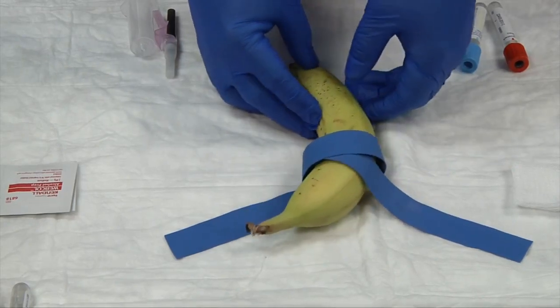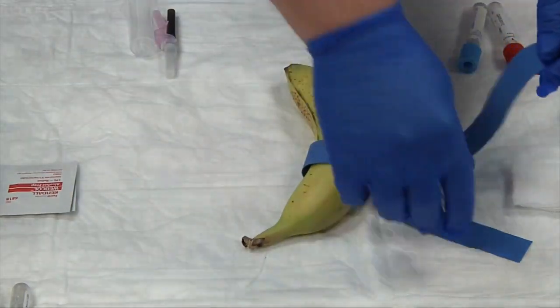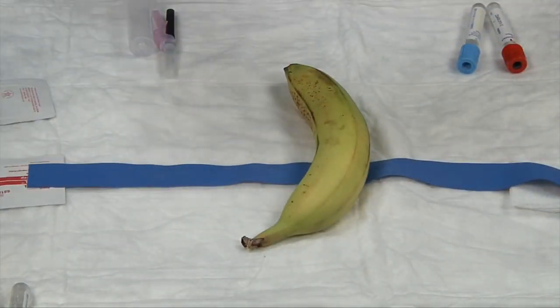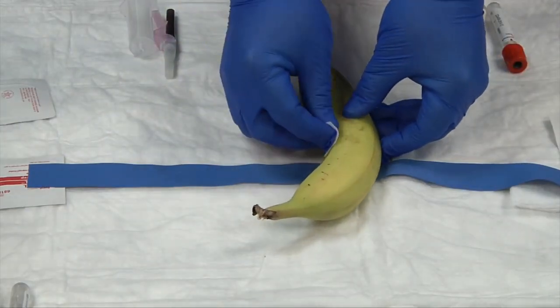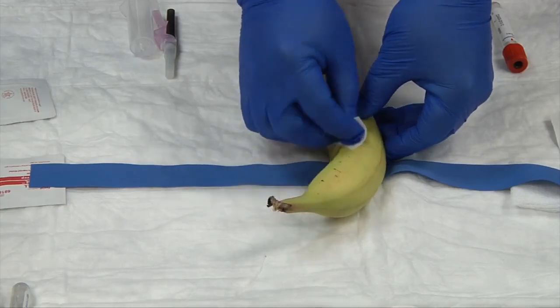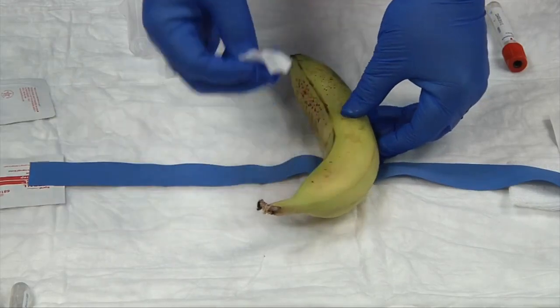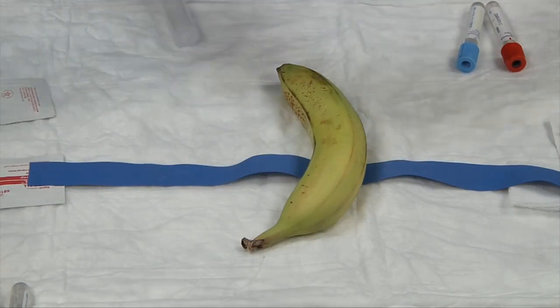As a new phlebotomist, until you pick up speed, you'll want to release your tourniquet while you cleanse the patient. Take your alcohol swab and start in the center where you'll do your puncture, then go in a circular method from inside out — never back in. We want to push the dirt away from the site.